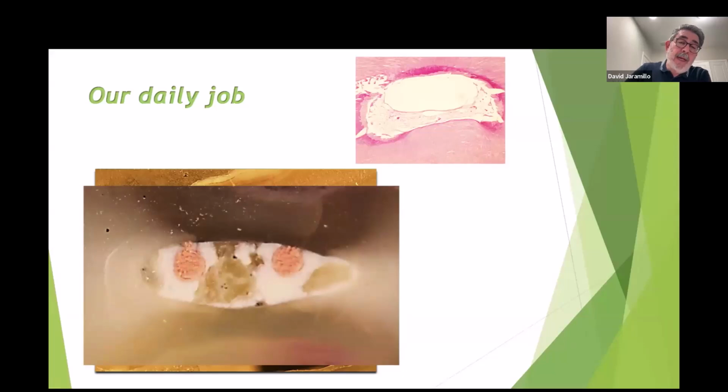This is a root canal done by one of the predoctoral students, right? Distal root canal of a lower molar, instrumented to the 35/04 with rotary instruments and obturated with a single cone technique, supposedly, with BC Sealer. BC Sealer has no problem flowing. See how nicely it flows around everything? Even in between here, the debris and the canal wall, it flows beautifully.